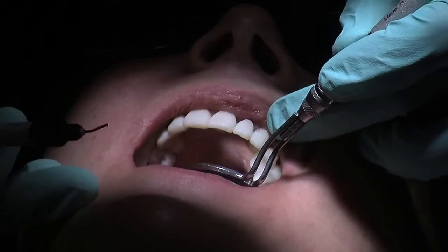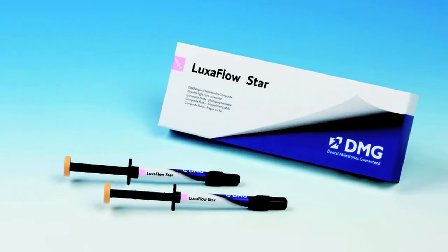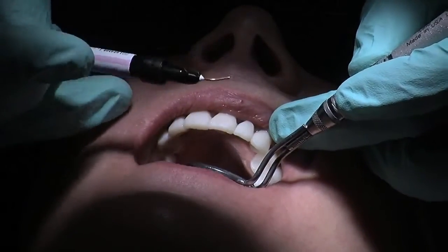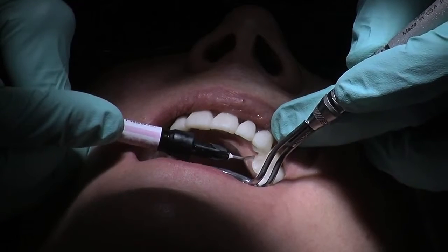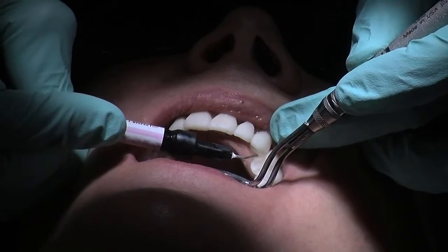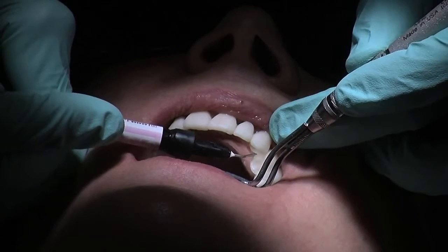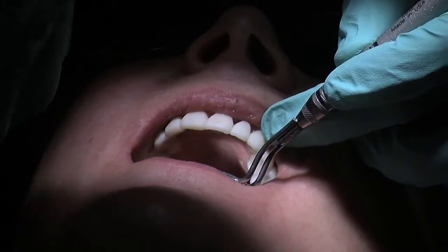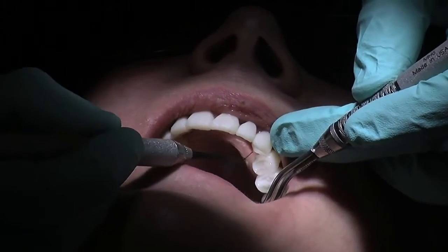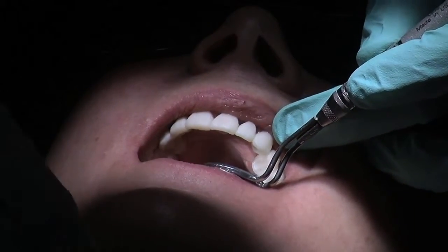So if there's a slight void or a little air bubble, then you can use Luxaflow, because this comes in matched color to the Luxatemp. This is Luxaflow B1. So there's just a tiny little void here on the inside, on the palatal side of this premolar. So I'm just going to add a little bit here. Then I'm going to use this other sort of spade instrument, that's what I call it. Let's get the shape perfect. And we need a light please now.